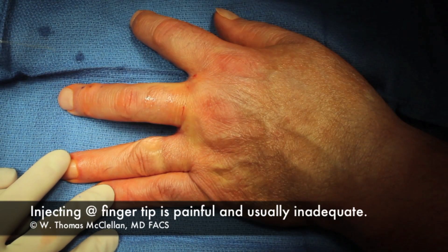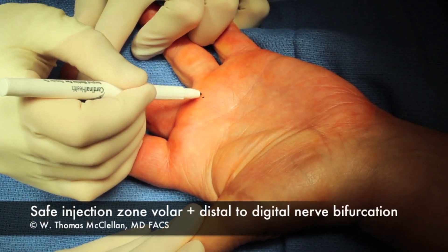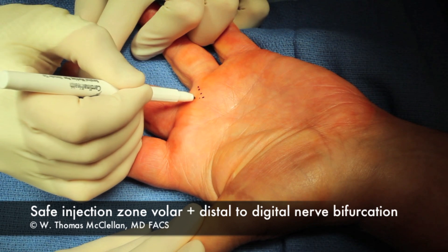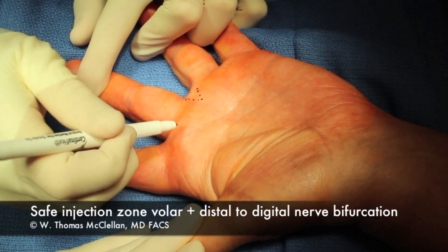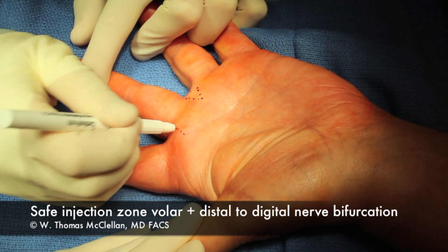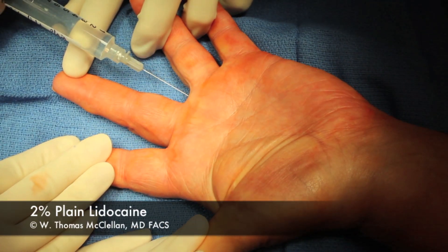Injecting out at the tip of the finger is often very painful and inadequate for the patient. I usually roll the hand over and inject volarly first and identify where the digital nerves will branch. There's a really nice injection zone there where you can get some local anesthesia in to numb up the finger.